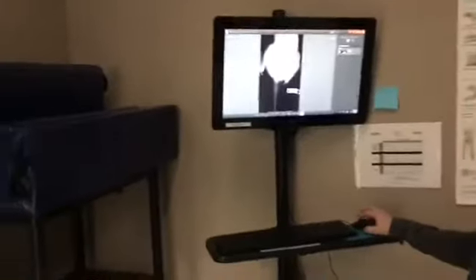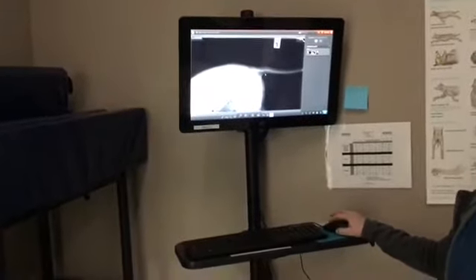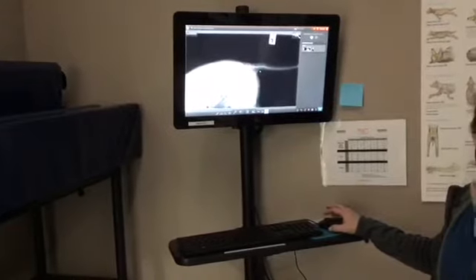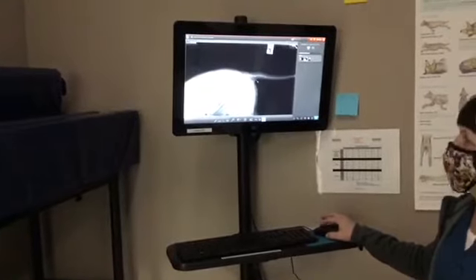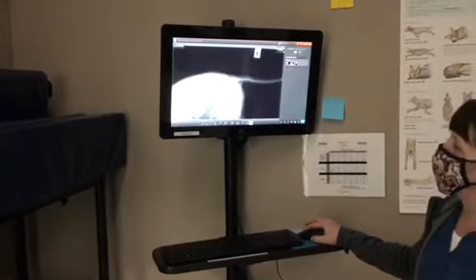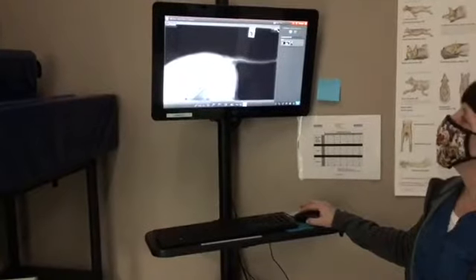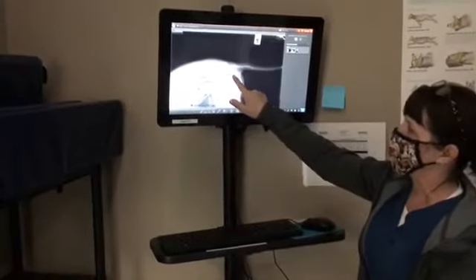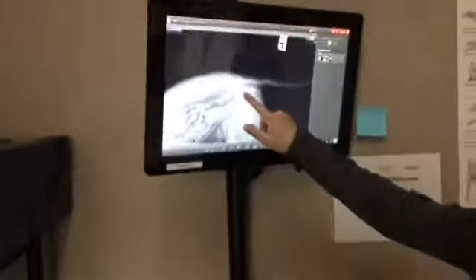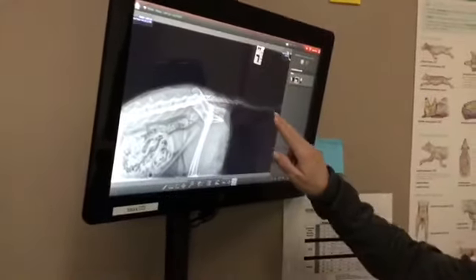So this right here is Maui's tail, and Maui had a tail injury that we needed to take an x-ray of and make sure it wasn't broken. So this right here, can you see my cursor okay? Kind of? Can you see me? Yeah. Okay, so this right here is his pelvis and his back legs. Okay, and this is his spine and his long tail.